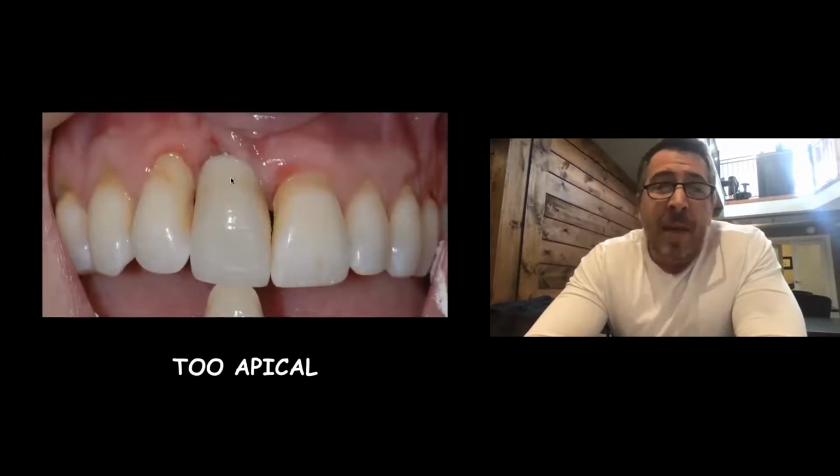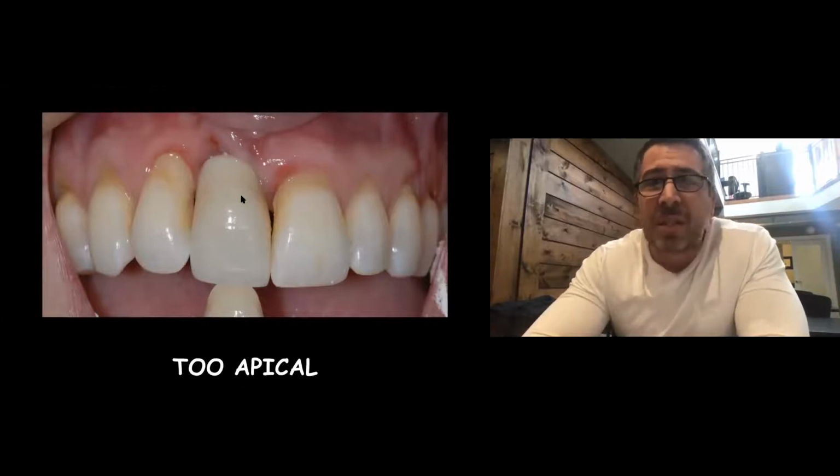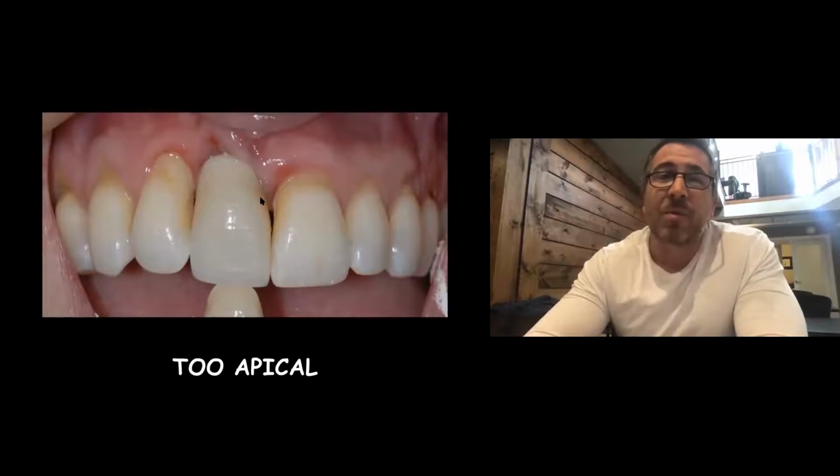If the implant is too apical, now that's more common. If there's been vertical bone loss and the implant ends up too apical, you're going to end up with one of two problems. If you don't have a good thick amount of soft tissue, you're going to have a zenith that's in the wrong position. Now, can we surgically correct that? That's our biggest challenge, trying to correct that vertical position of bone. Sometimes we surgically just can't fix that, so it's not achievable. Now it's going to have to be fixed on the restorative side.